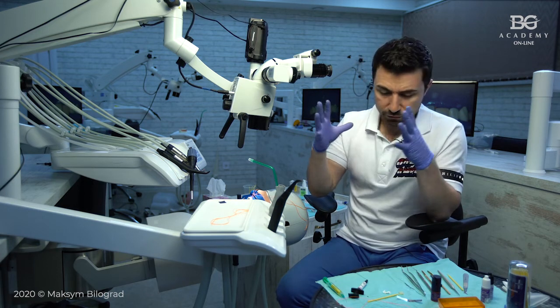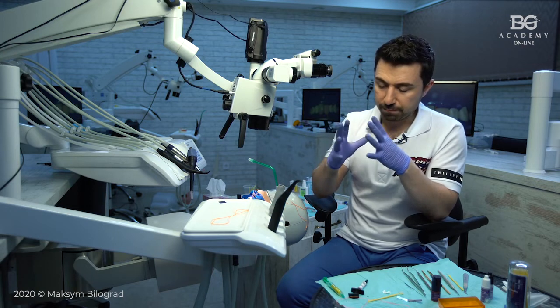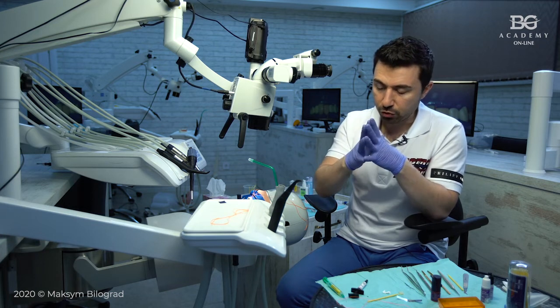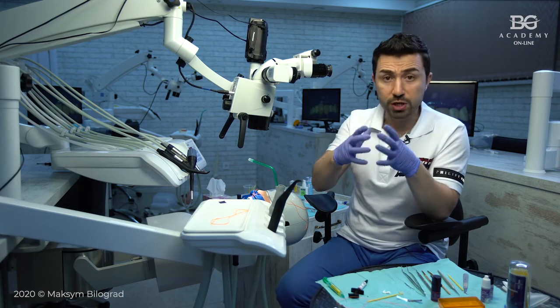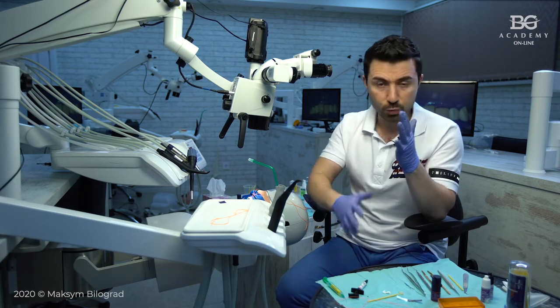The shrinkage is a three-dimensional, internal shrinkage, and the direction is towards the adhesive surface. In our case, we have two adhesive surfaces. We have tooth and we have ceramic.